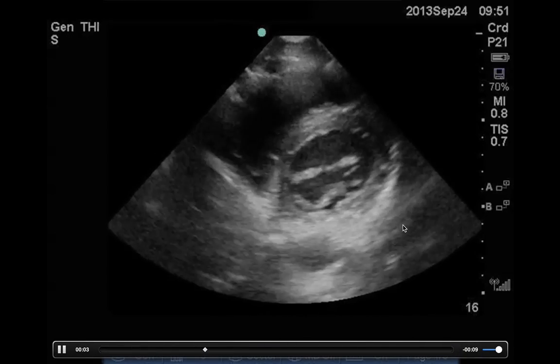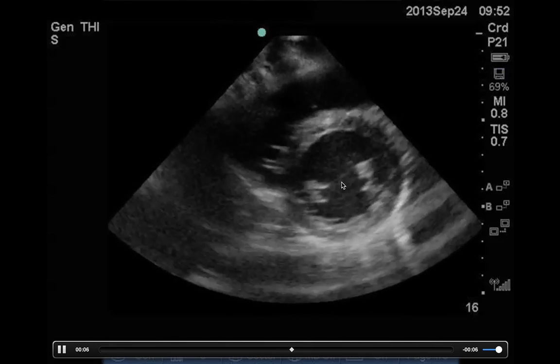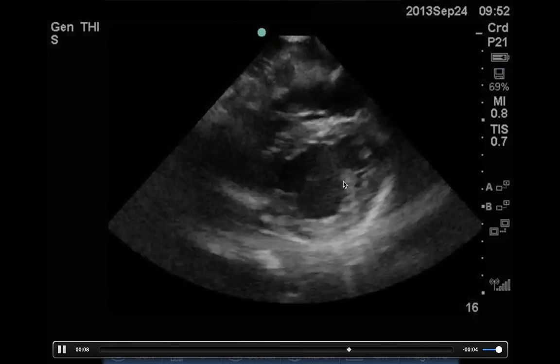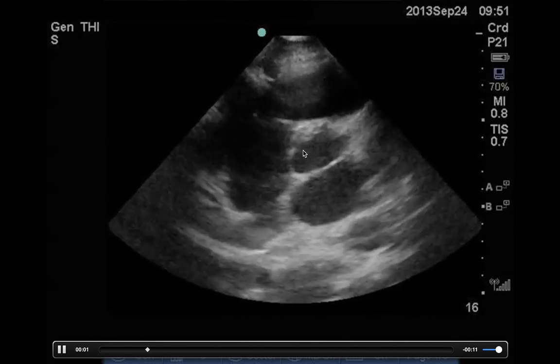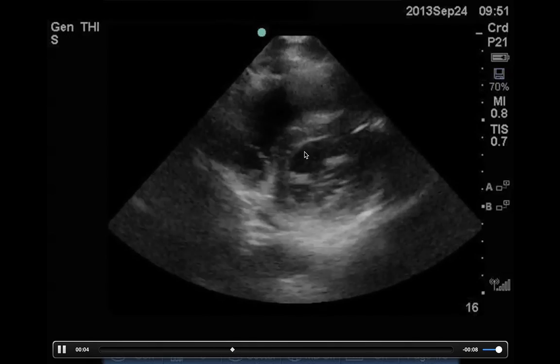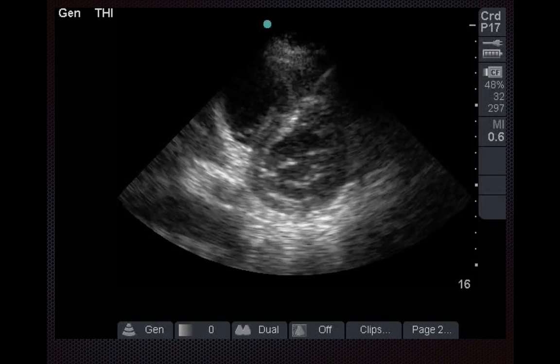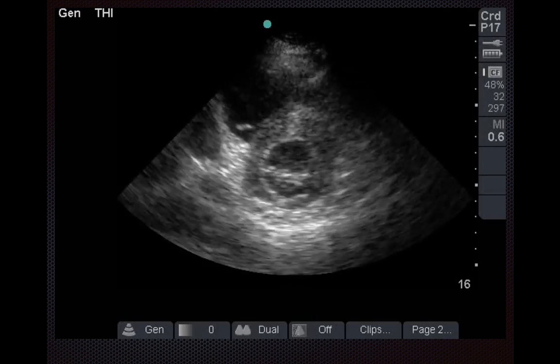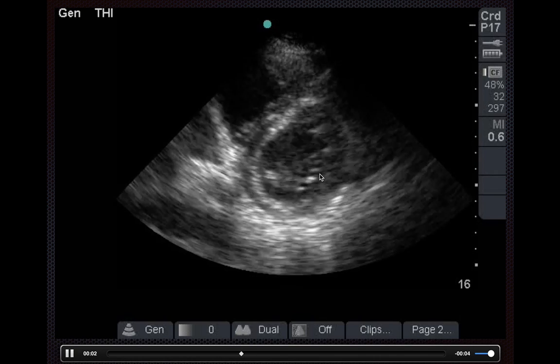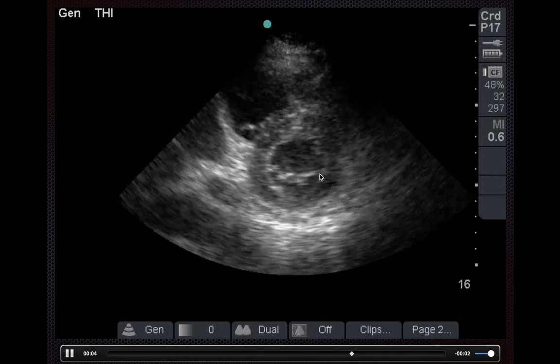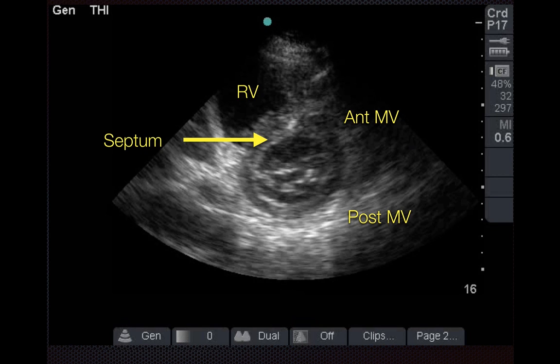Here we have the bi-leaflet mitral valve, and then as you start to scroll back up you're going to start seeing what we call the Mercedes sign, or the tri-leaflet aortic valve. Let's go through some of the structures more closely. This is the bi-leaflet fish mouth view of the mitral valve. Anatomically you're looking at the septum, the right ventricle, the anterior mitral valve leaflet, and the posterior mitral valve on the bottom.